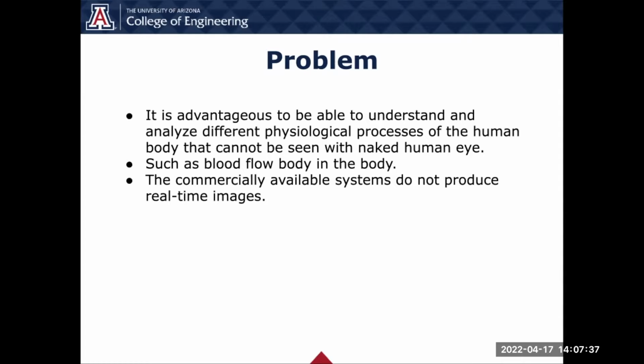The problem we are facing is to view physiological processes with the naked human eye. With that being said, it's advantageous to be able to understand and view these, and normally that cannot be done just by looking at them. Some examples of this include blood flow as well as perspiration levels, and our system will be able to produce real-time images that current commercially available systems cannot produce.